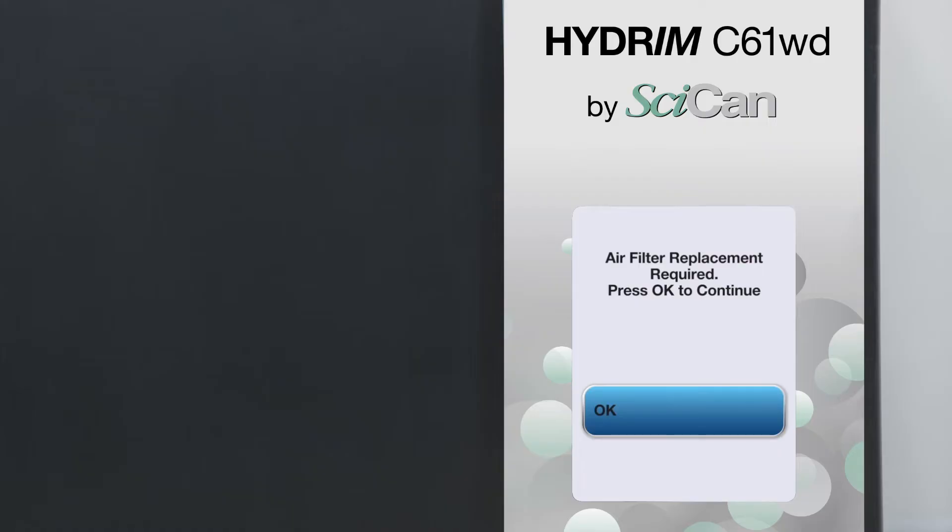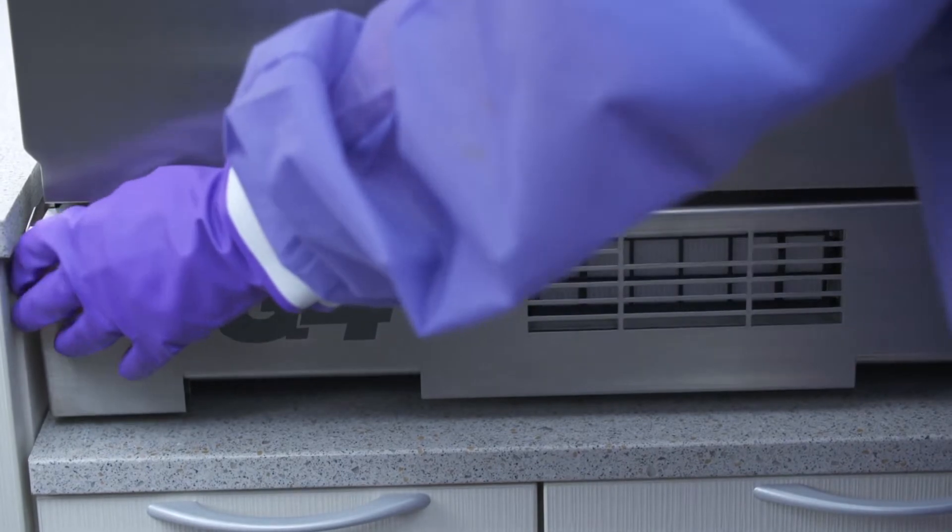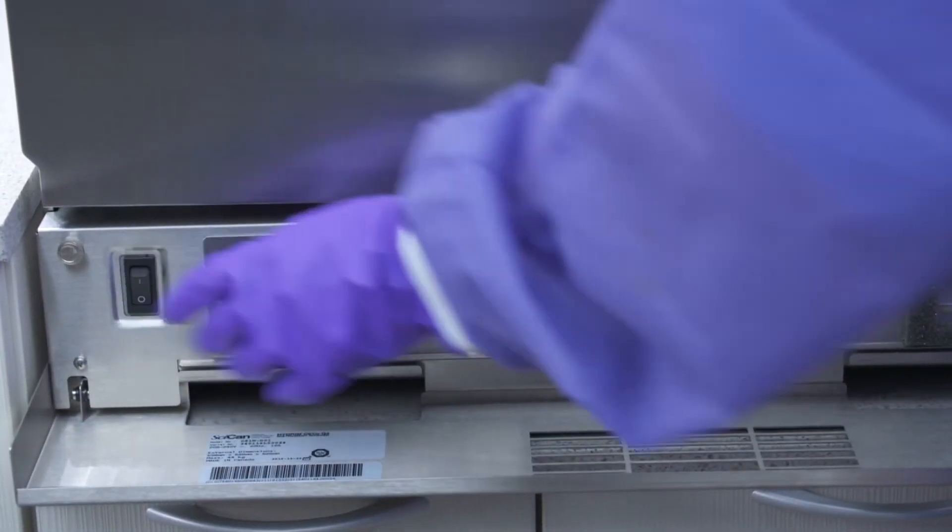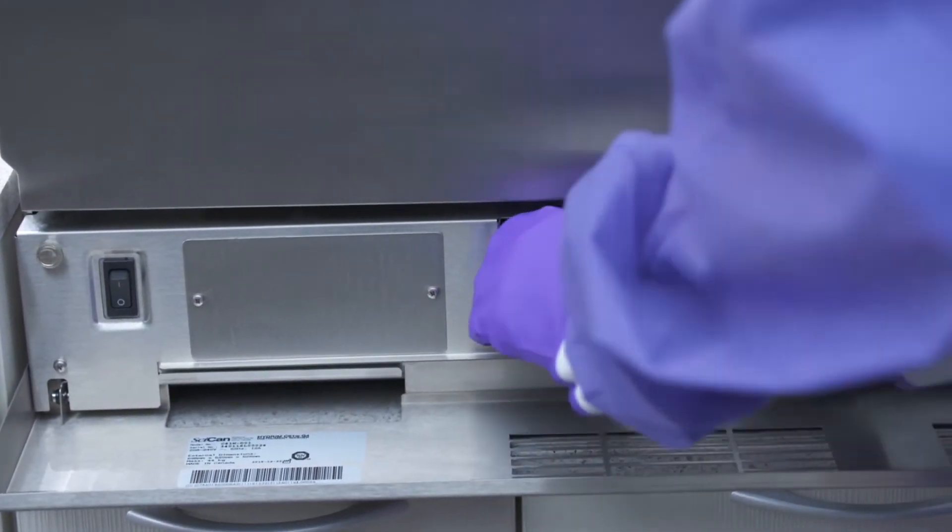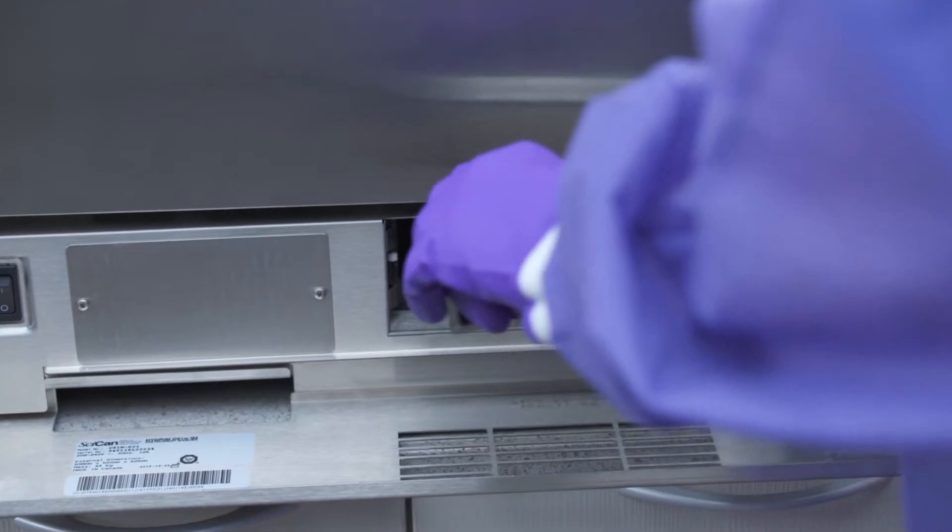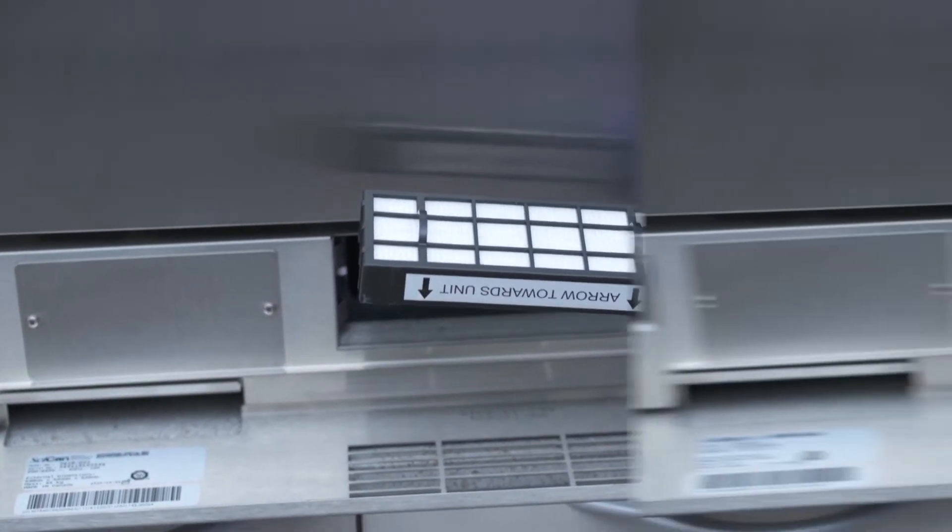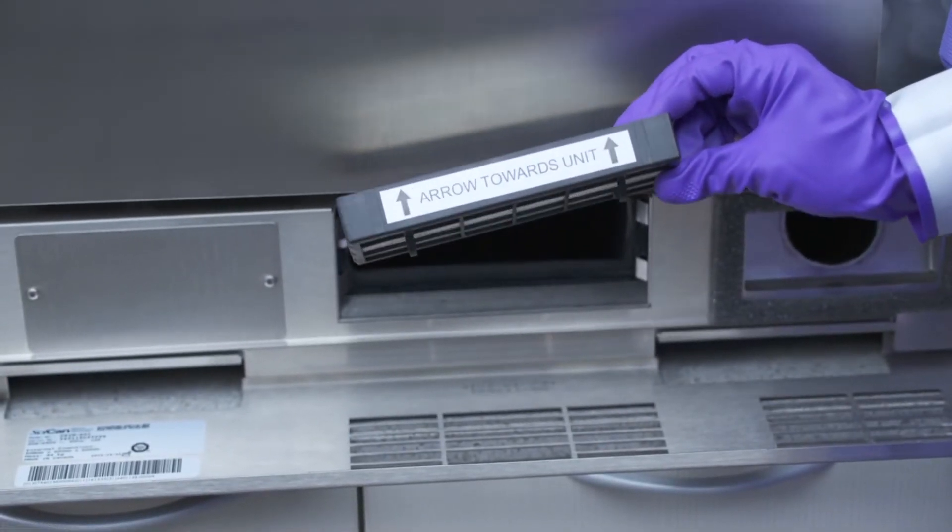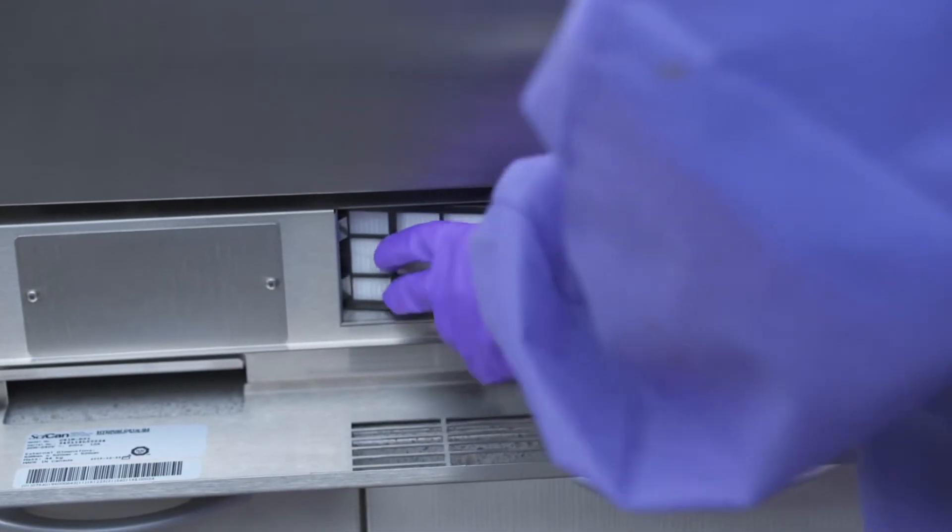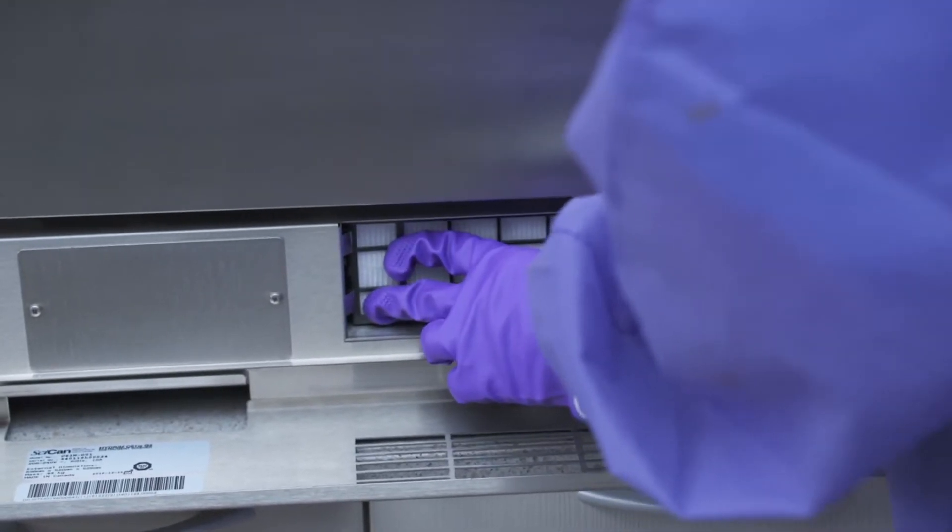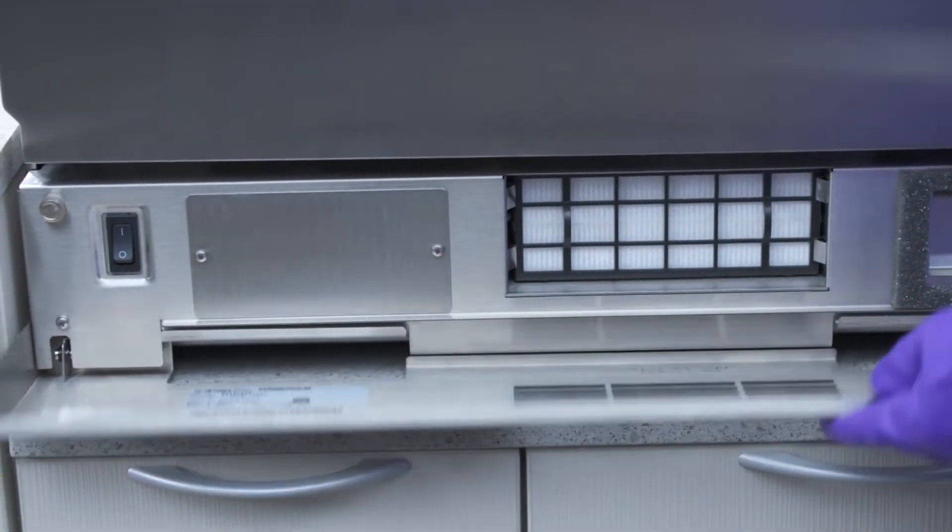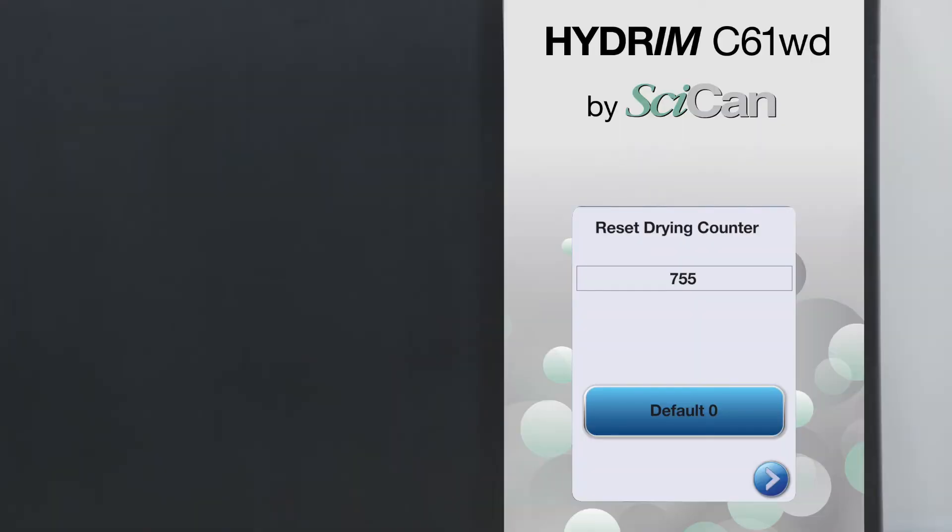You will see a message 'replace air filter' after every 750 cycles. HEPA filter is located inside the kick plate below the front door. Replace the filter and reset the drying counter to zero.